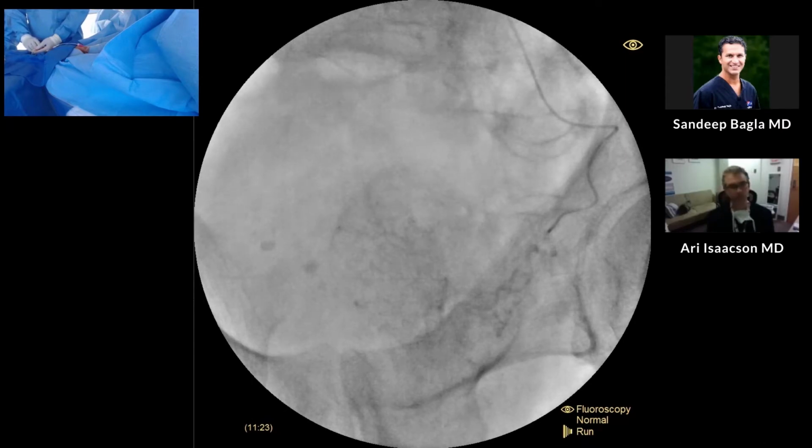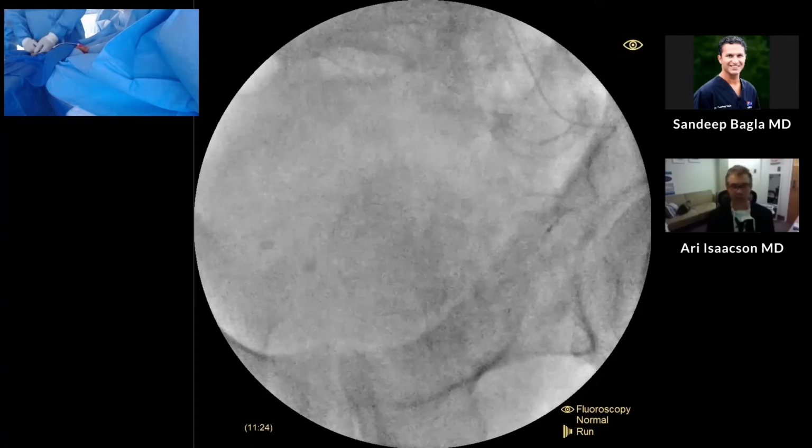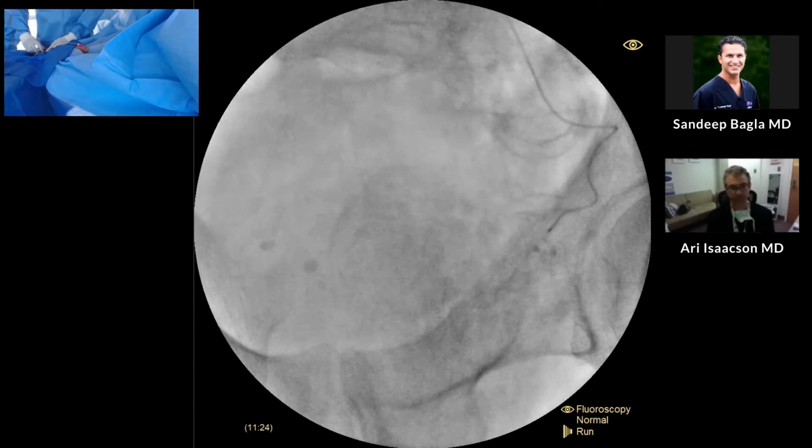So what are you typically using in that situation? Well, honestly, I haven't found a solution yet. What I'm really looking for when we're talking to our supply folks is something around 150 centimeters, either a Vert, Bernstein, or Cobra type shape. I think that's going to be ideal, but I haven't identified it yet. Yeah, I would agree. Even something slightly shorter, 140, might be good. So you have 35 cm hanging out. Yep.